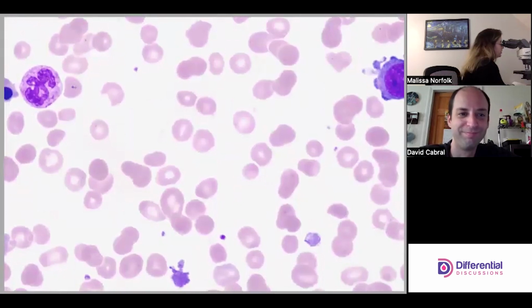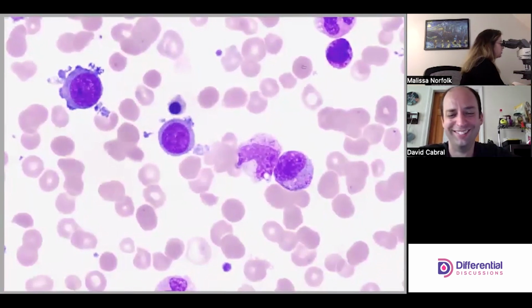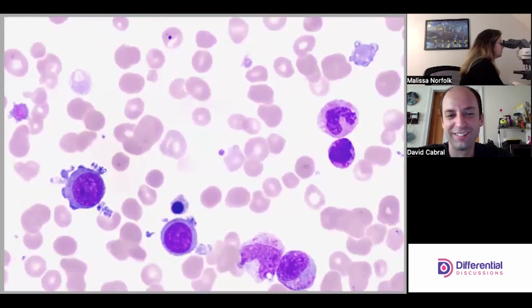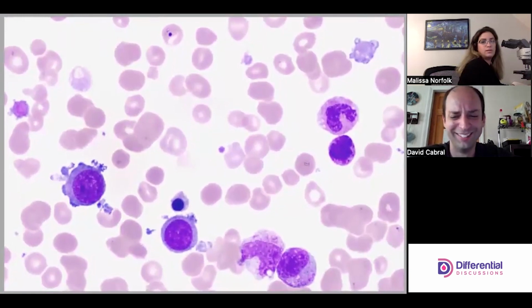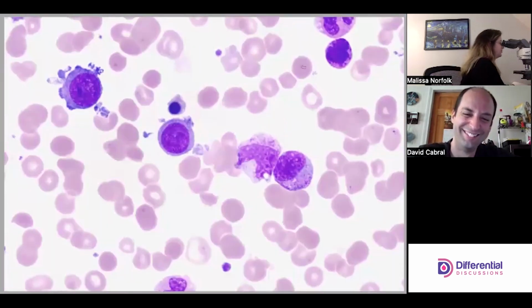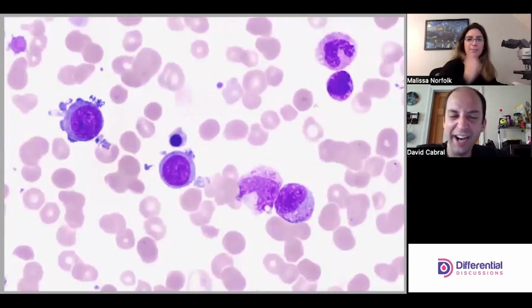We're gonna go this way. I'll take one of everything. All right, you want to take the lead here? What do you want to start? I'm trying to pull it up a little bit higher. Too high. There we go. Okay.